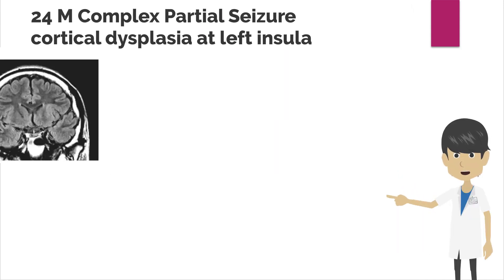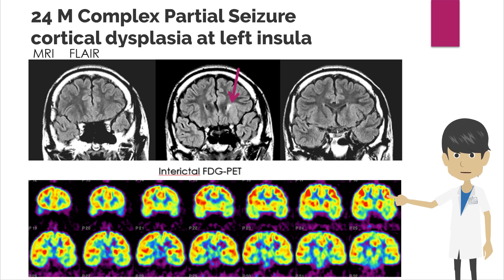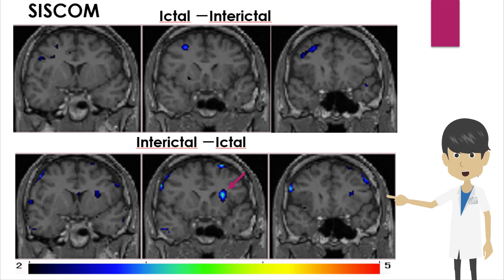SISCOM analysis usually aims to detect increased perfusion in the epileptic focus during seizures. However, if the seizures are short, the brain may already be in a postictal phase when the brain perfusion tracer reaches the brain. In this case, the perfusion in the epileptic focus may be lower than in the interictal phase. In this case of epilepsy with complex partial seizures, the MRI FLAIR shows a high signal bordering the slightly thickened left insular cortex, and focal cortical dysplasia in the left insular cortex is suspected. FDG PET does not show any abnormalities. In SISCOM analysis, subtraction of the ictal SPECT from the interictal SPECT shows decreased perfusion in the ictal phase in the left insular cortex adjacent to the high signal area seen on MRI. Thus, evaluating not only the increase but also the decrease in perfusion is useful for focus detection.